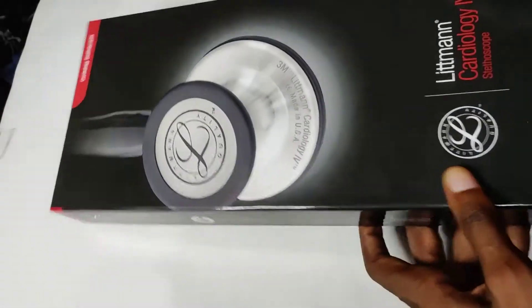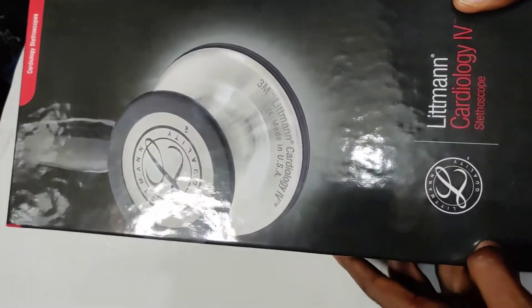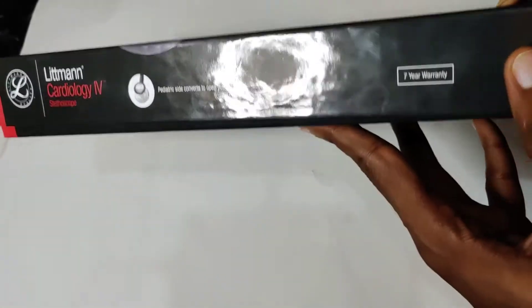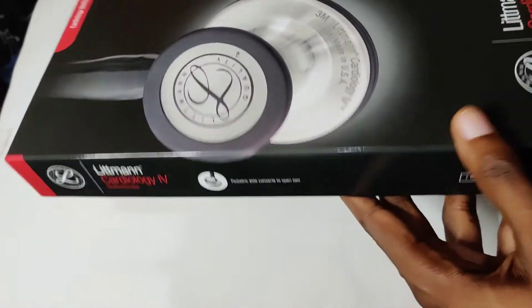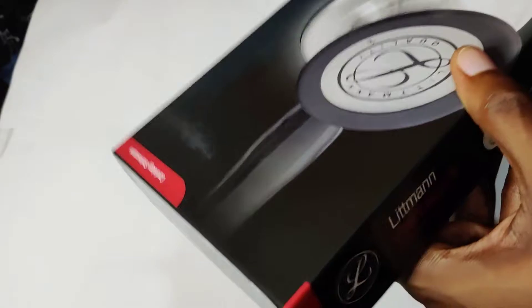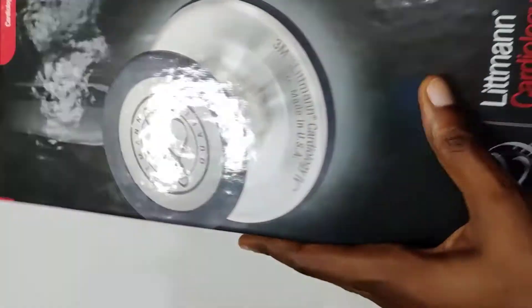Welcome back guys. As you can see I'm holding the Littmann Cardiology 4 stethoscope. In this video we'll be reviewing how to identify the original and also the fake. Here we have the seven-year warranty by Littmann, and you can also register the serial number via the official website to claim your warranty.